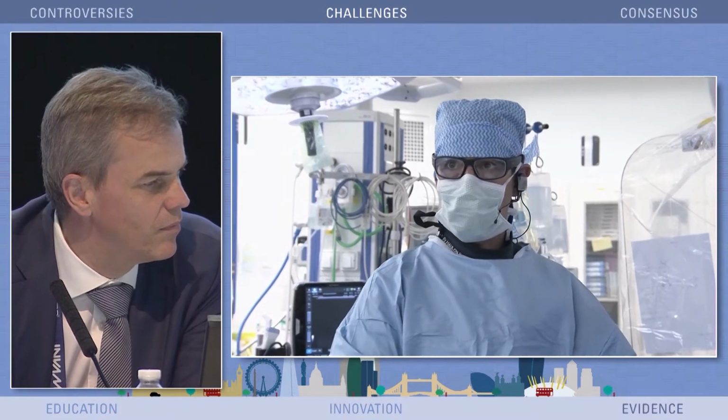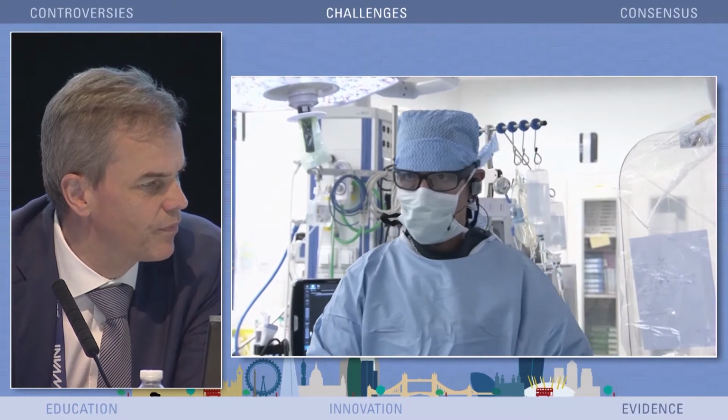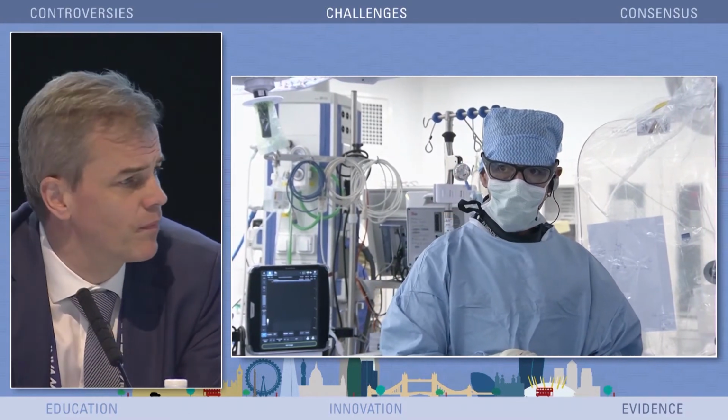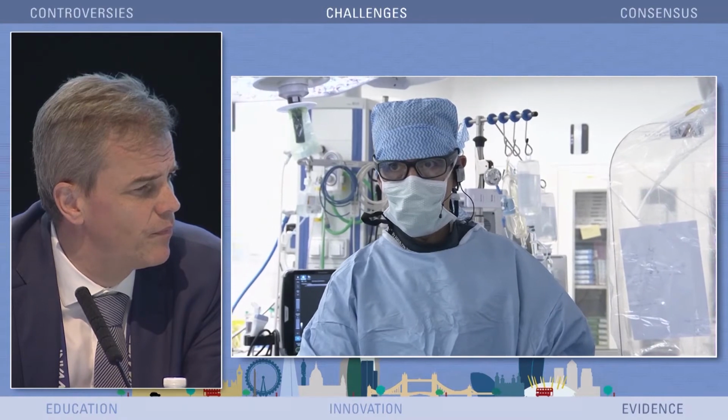So you can see that he has a diseased left internal carotid artery, but we decided that it's asymptomatic. We're not going to treat him. Renal function is okay. And so the ASA score from the anesthesiology was 3.